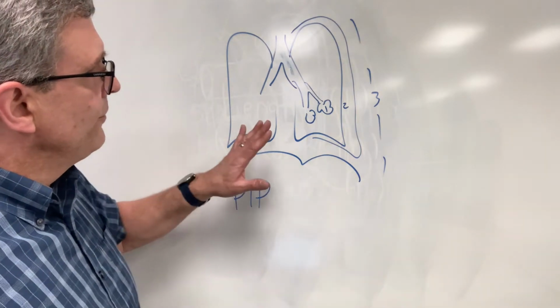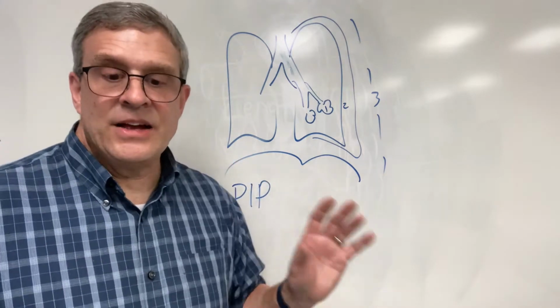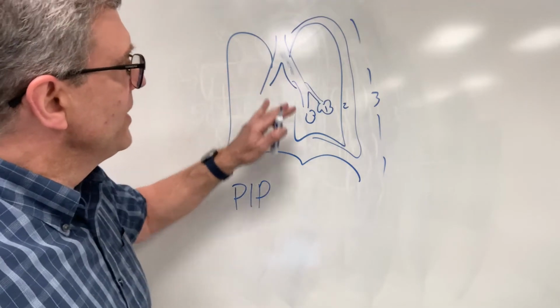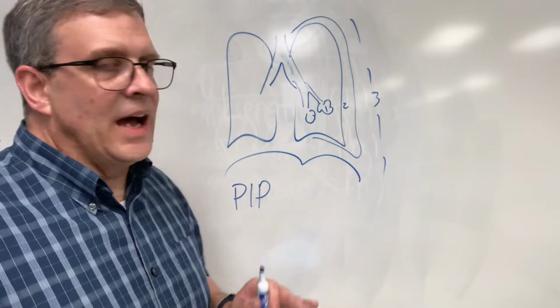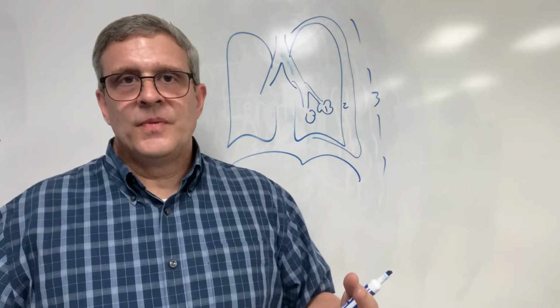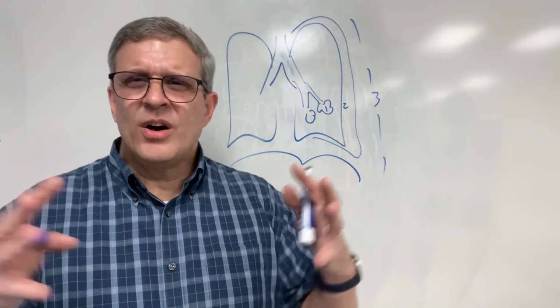Now, what if we were only interested in how stiff the lung is? In other words, I'm not really interested in airway resistance. I just want to know, when that gas is in there without resistance, how hard is the lung pulling in?